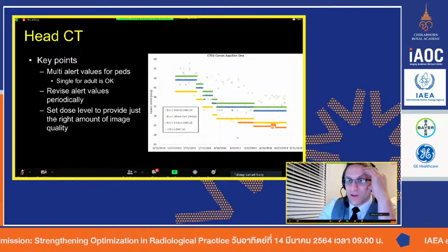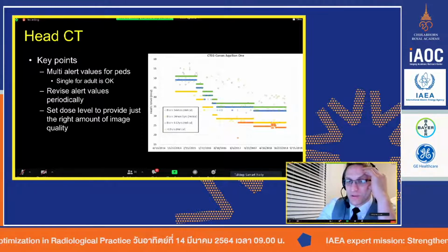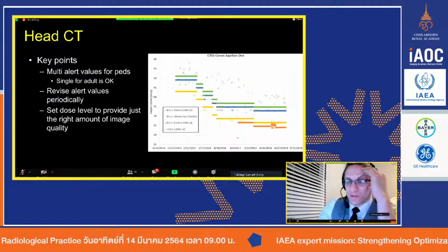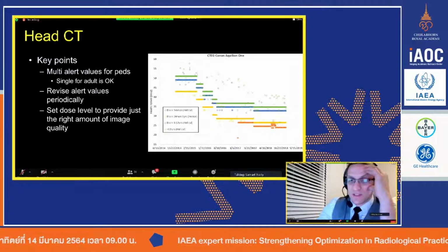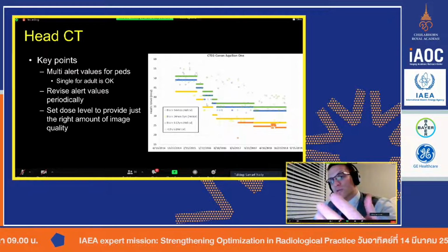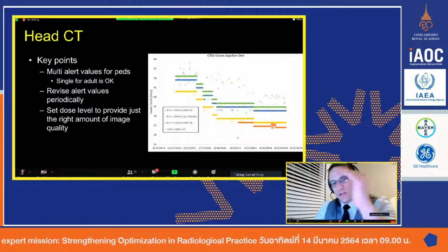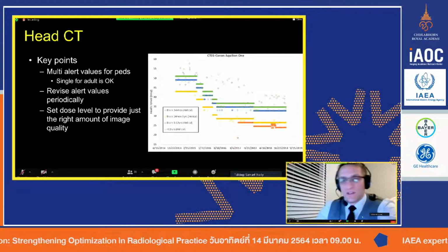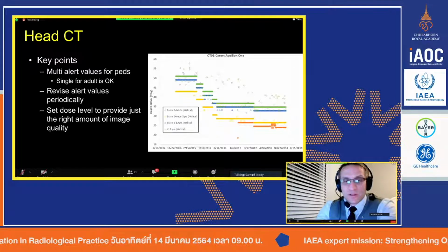And so if you have an alert level that's set all the way up here, you will never see this problem. But if you have multiple alert levels, if you have multiple protocols, then you can even catch these weird subtle issues. And once you have your new tech software, your Bayer or your Radimetrics, setting multiple alert levels is really easy. And then you'll just get an email every so often when something goes above that alert level.